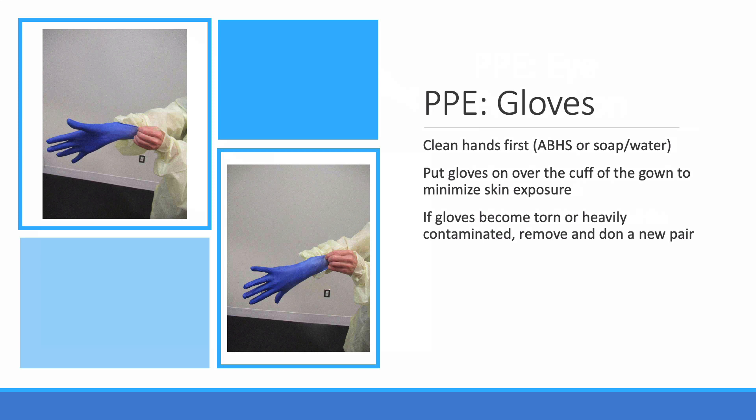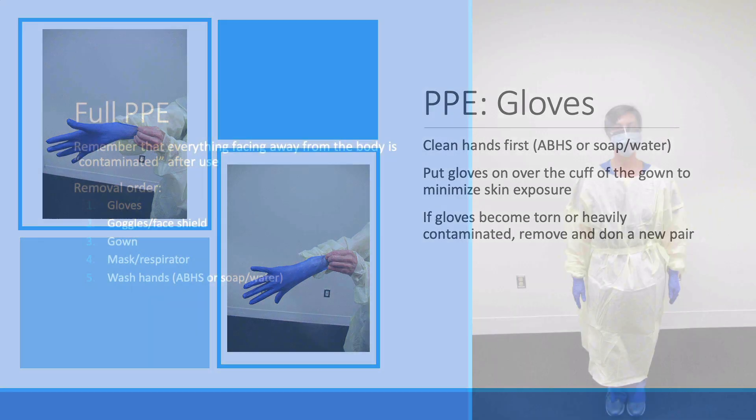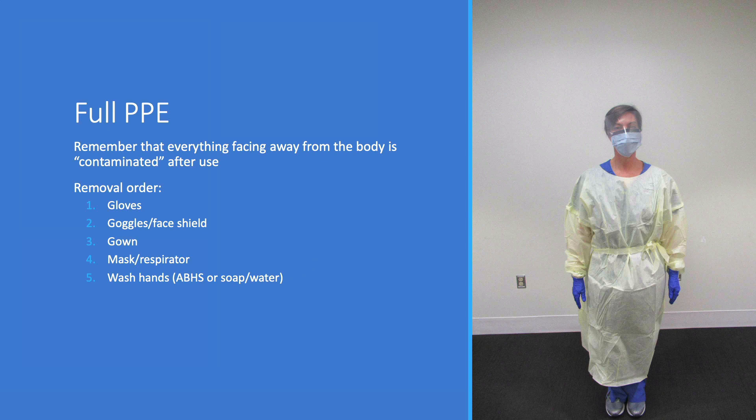Gloves are the last item to put on before seeing the patient. We're probably all skilled in putting on non-sterile gloves. Make sure that the gloves fit and the cuff of the glove fits over the cuff of the gown so none of your skin is exposed. Here we have a fully-gowned respiratory therapist. Remember that everything facing outward, once she goes to see the patient, is considered contaminated.